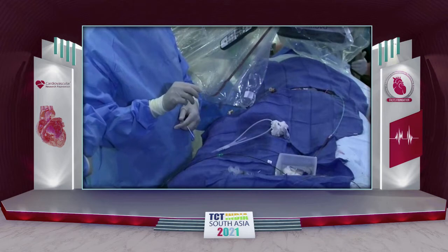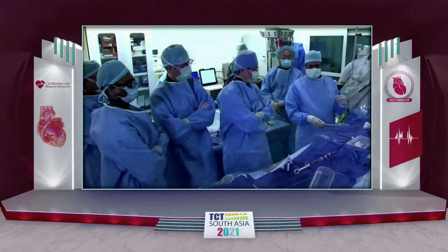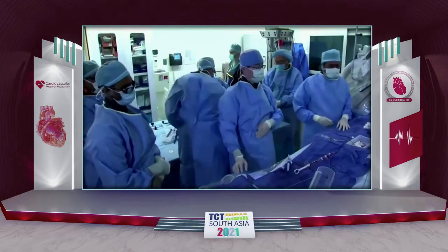And while you're injecting through this, inject at another point. So in our lab, we don't use the 18 gauge needle anymore. Whether it is sticking the artery, vein, or pericardium, micropuncture is what we use. And I think that it makes a difference in making things safe.